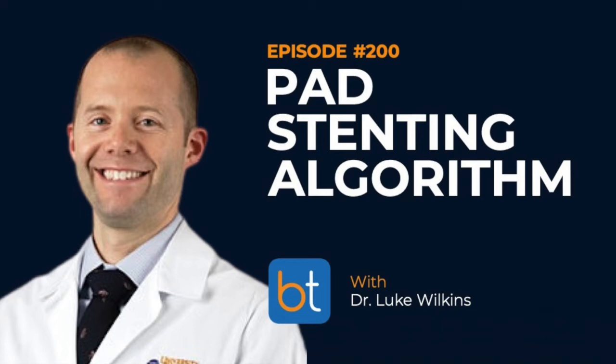All right. So that covers the easy stuff on our flowchart. Now we're getting to some of the harder stuff. So let's say you come across an occlusion. Tell me what you do. So the first thing that I do is try and cross it true lumen. I will say that, not to use the 10 centimeter rule again, but it seems that if it's less than 10 centimeters, I have a higher likelihood of being able to cross a lesion true lumen. That being said, I'll try on every single one.